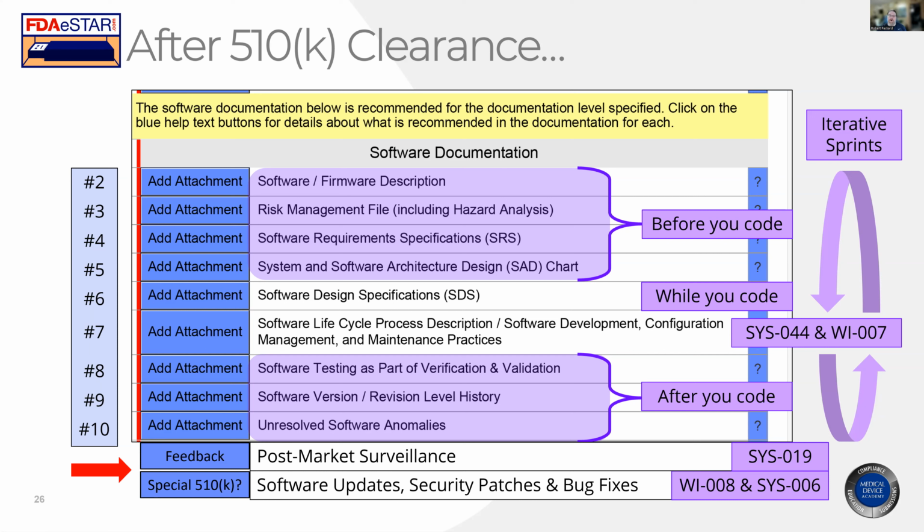Do not forget, you should also be asking, is there anything in the instructions for use that wasn't clear? That would be a great question. A labeling question. Is there anything you think we ought to add or make more clear in the cybersecurity labeling? There's a thought. Maybe there's something in the training materials we should update. Maybe there is something where you could ask, what indication for use have you used it for? Rather than asking the question, are you using it for this indication? Have it more open-ended, like a good interviewer or a good auditor. What indications do you use this for, and see if they're using it off-label?